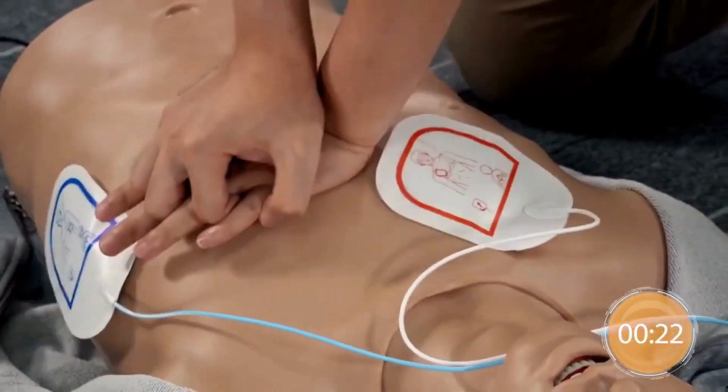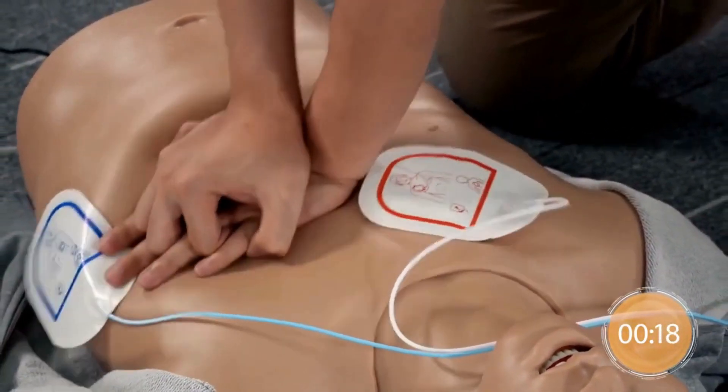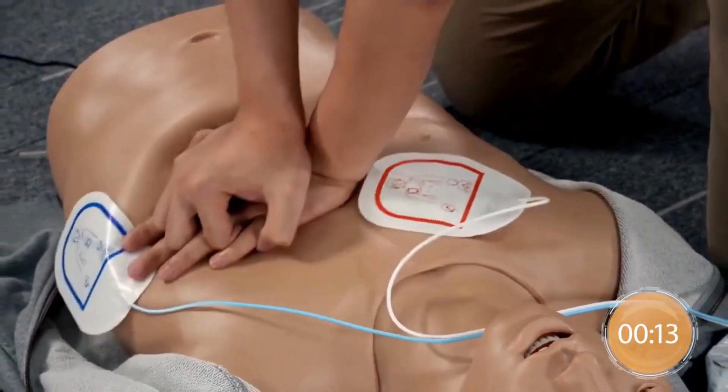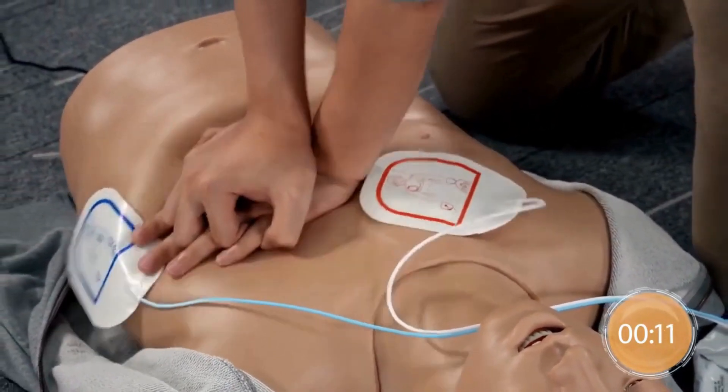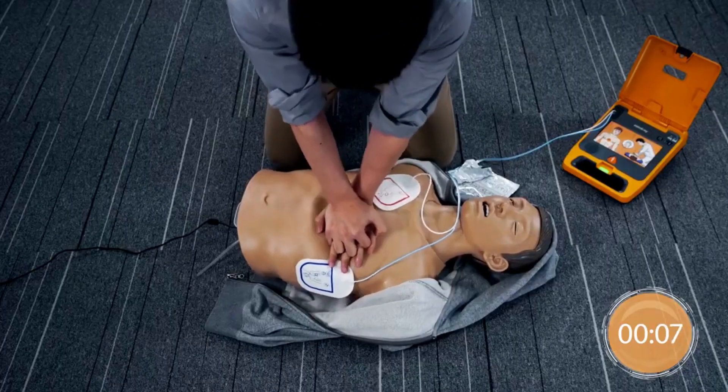Continue to push down hard. Give chest compressions immediately. 20 compressions remaining. Push down hard.